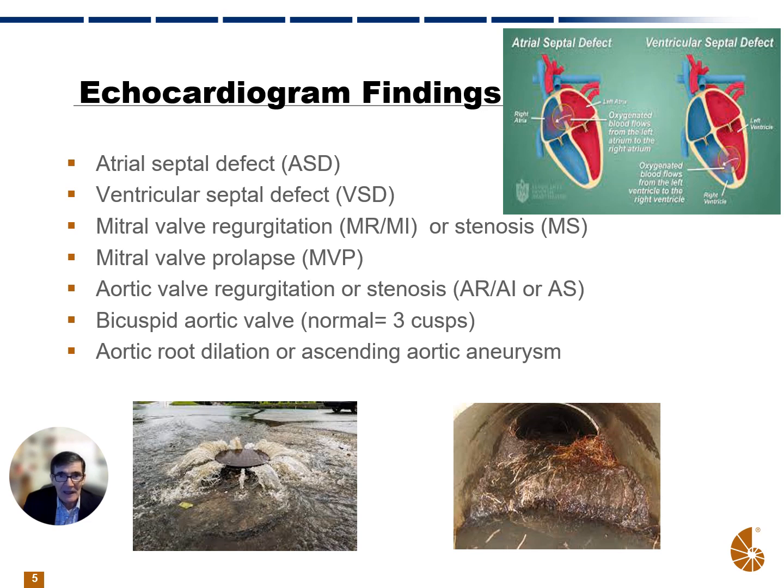Additionally, an echo could be used to assess the size of the aortic root, where the aorta attaches to the left ventricle. Is it dilated, which may be a problem because it could rupture at some point in time, or are there problems with enlargement of the ascending aortic artery causing an aneurysm?